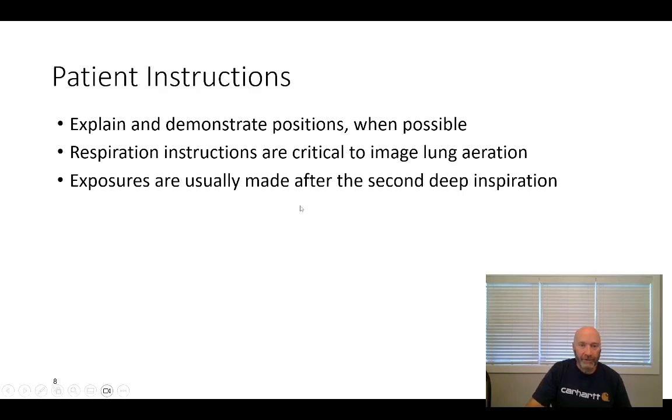The patient instructions: you want to be very deliberate and succinct in your patient instructions. Don't overload the patient all at one time, but feed them the information that they need whenever they need to have it. Like, you wheel the patient up to the wall bucky and you ask them, can you stand up?